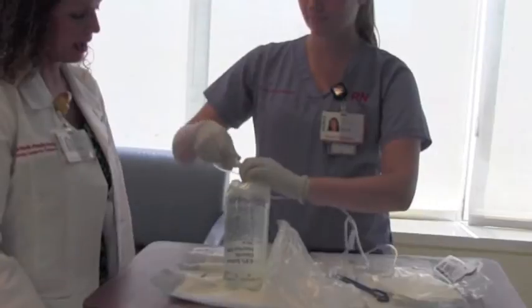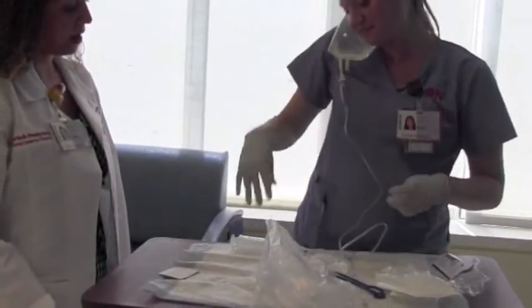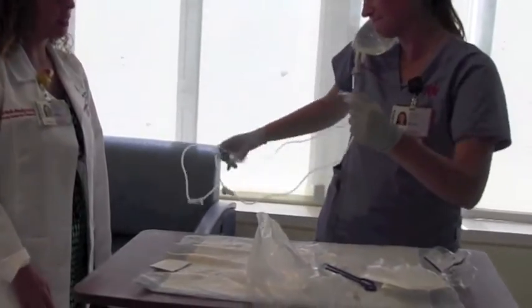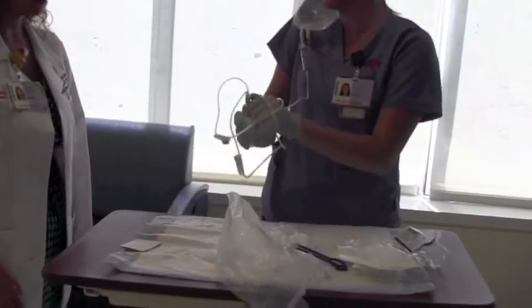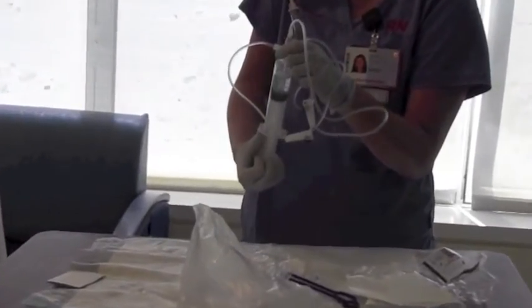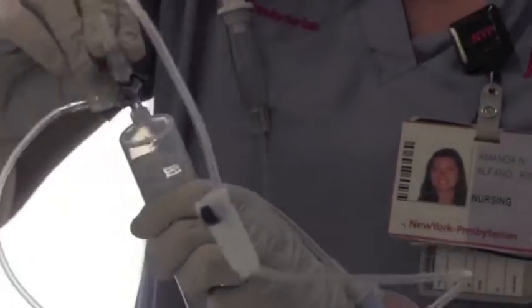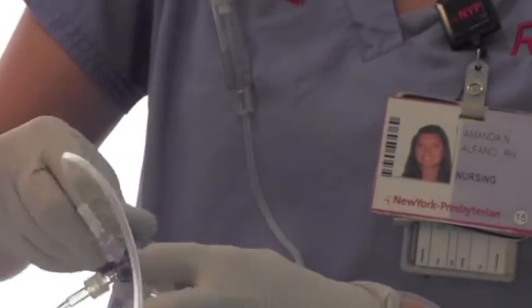So we'll spike the bag, and then we have to prime it. A lot of times the tubing isn't long enough to reach the patient's IV site, so you may have to brace the IV fluid bag in between your cheek and your shoulder if you don't have an IV pole readily available. So right now we're priming the tubing that's going to attach to the patient.